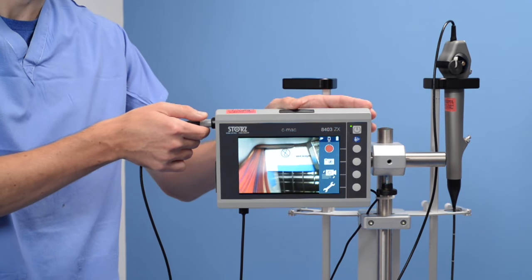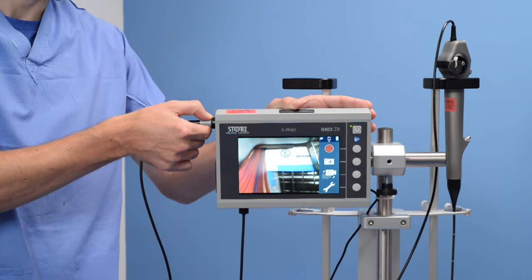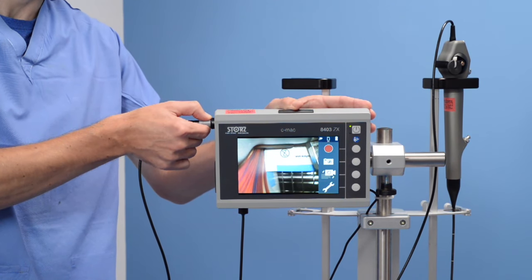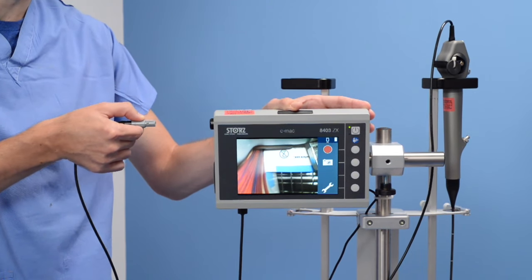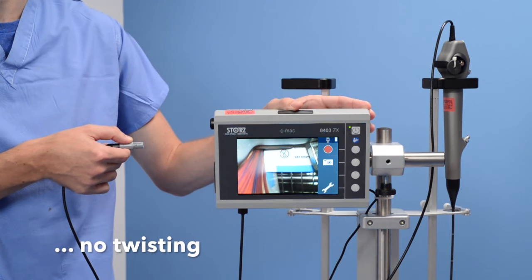To remove the connector, gently hold the grey collar on it and pull straight back. It will just gently slide out. Again, no twist.